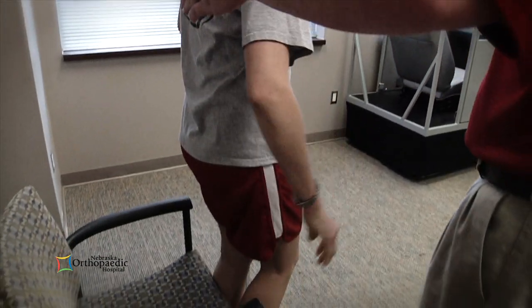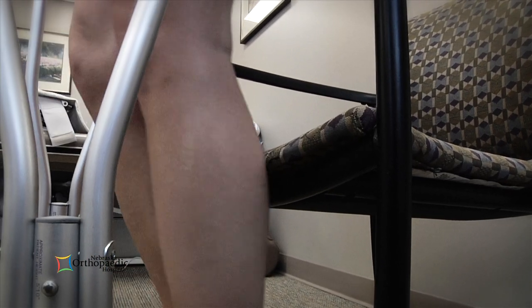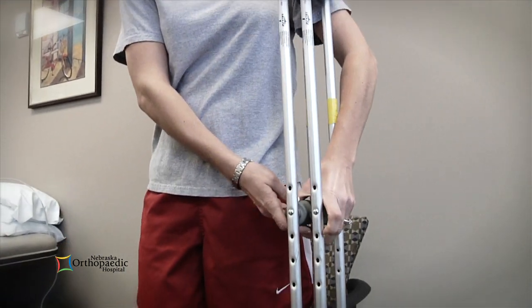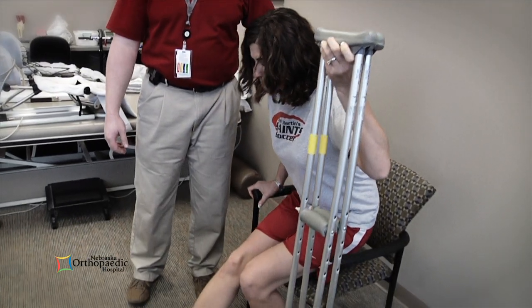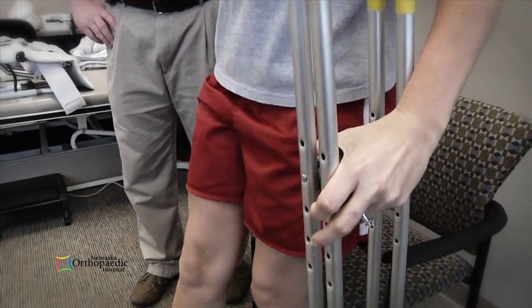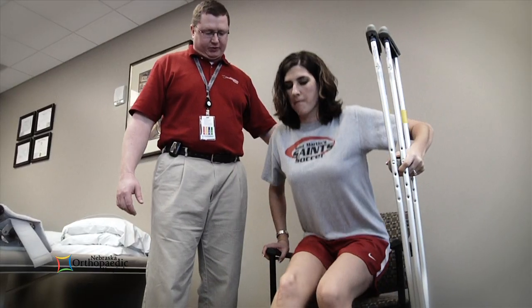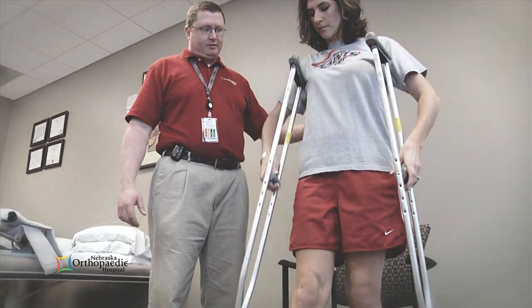When sitting, use a sturdy, high-seated chair with armrests. To sit down, first back up until you feel the chair with the back of your legs. Hold both crutches on the side of your injured leg and grab the armrest or side of the chair with your free hand. Lower yourself onto the chair and slide back if necessary. To stand, keep your crutches in one hand and grab the armrest or the side of the chair with the free hand. Lean your shoulders forward and push yourself up using your good leg and arms.